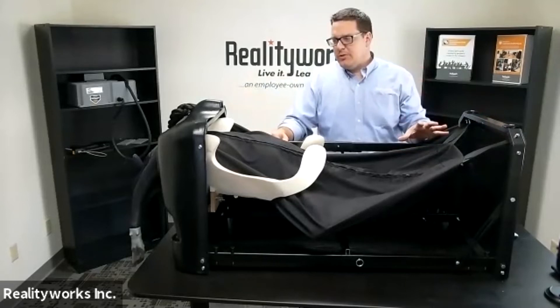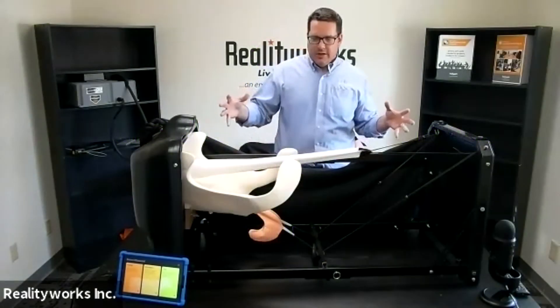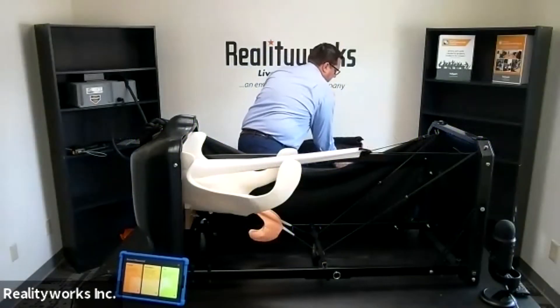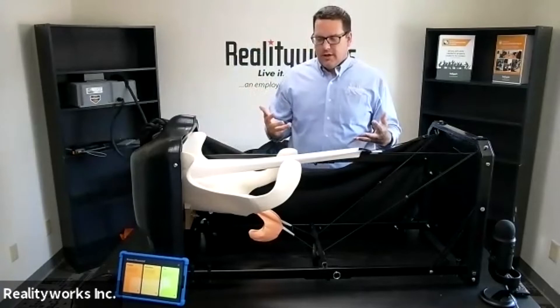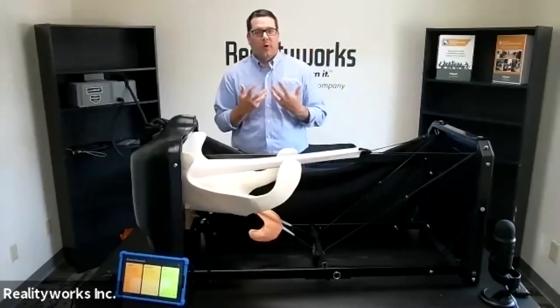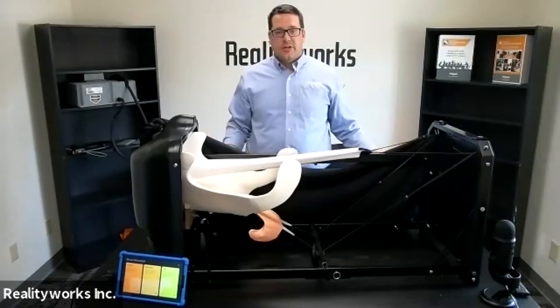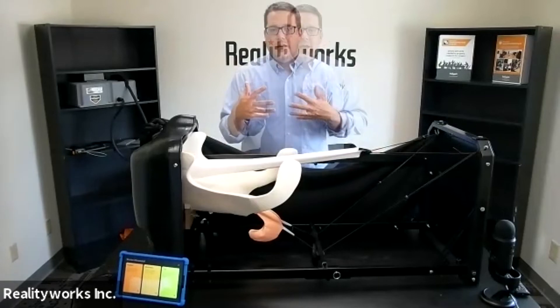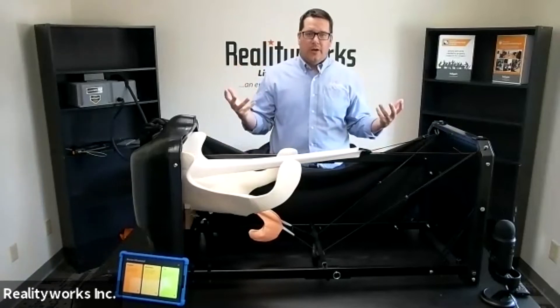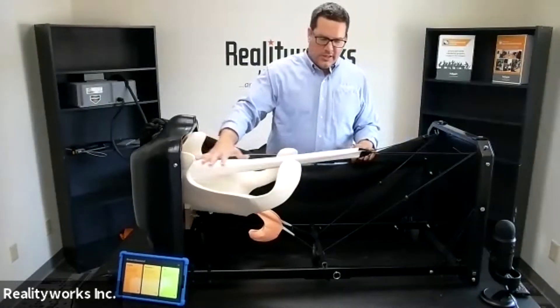Now I'm going to switch this out and go to the ultrasound side. I've removed the birthing tract — the calf's inside — and now we're focusing on ultrasound. Our focus here is getting the understanding of what ultrasound is, being able to try it themselves, understand where the different locations are, and getting students able to learn all the different facets. It's a great tool for adding technology into how you interact and work with an animal. With the hide removed, you can see our digestive tract here, which is on a bungee cord system so it can be moved back and forth.